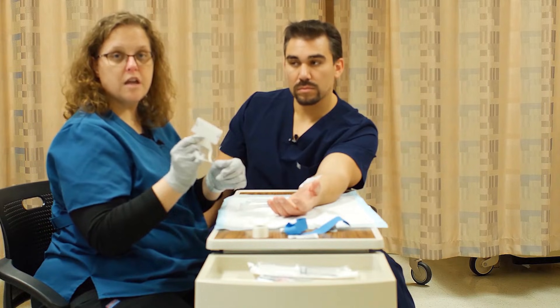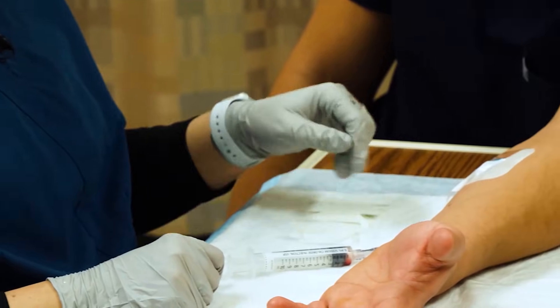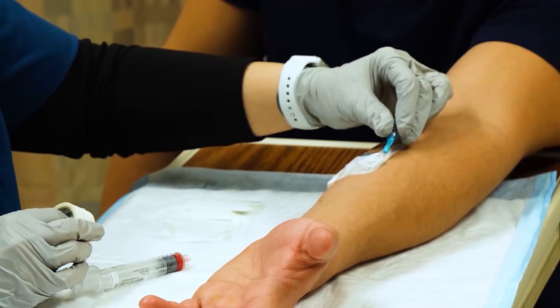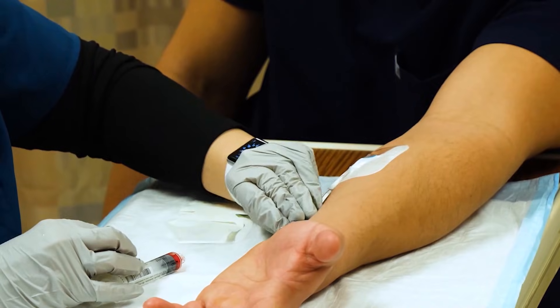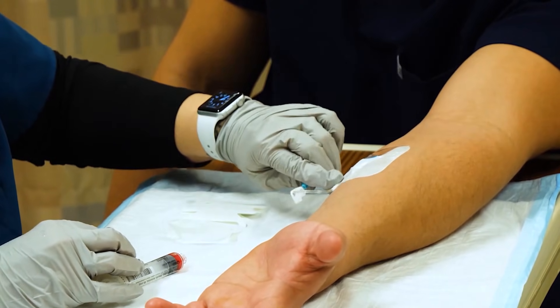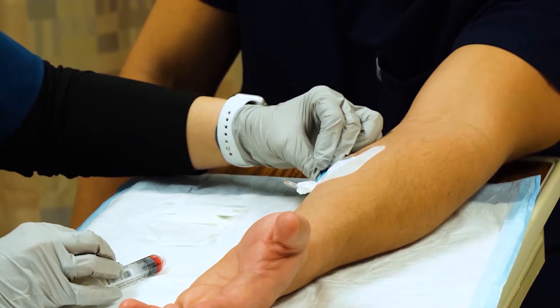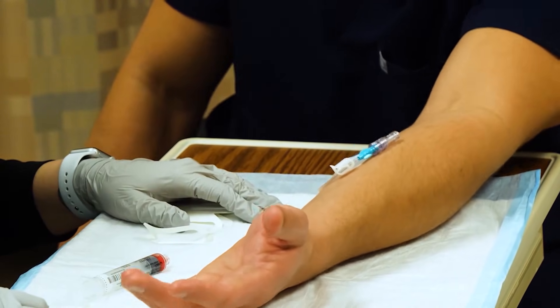If I want to further secure this, I can put tape around this piece — just unhook here and tape this anywhere it's going to be out of his way. You can see the way this one is curved — it wouldn't be smart to tape it so it gets hung on things. And that's really all there is to starting an IV.